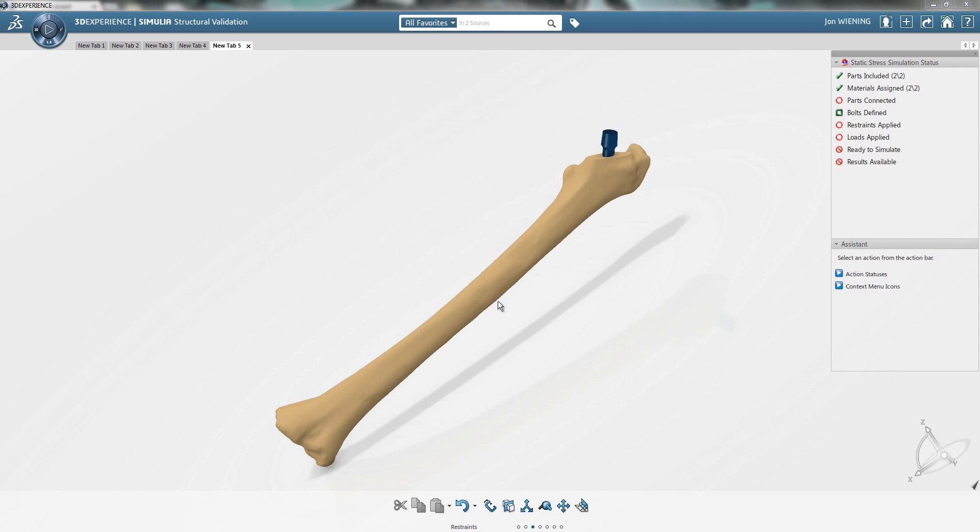Here we have an assembly of a femur bone and a hip implant device. Our goal is to determine how well this particular implant design is going to work in service. So we'll test it virtually inside of Simulia Structural Validation.